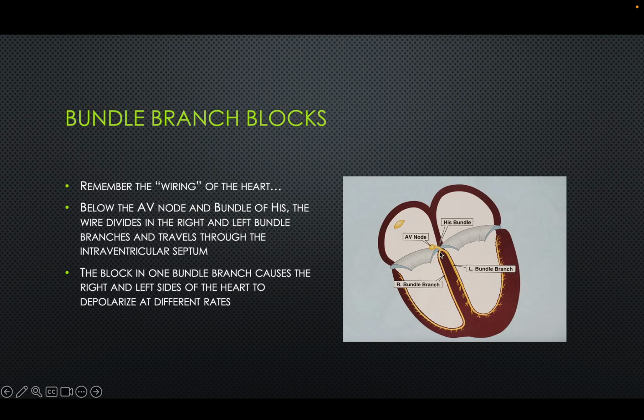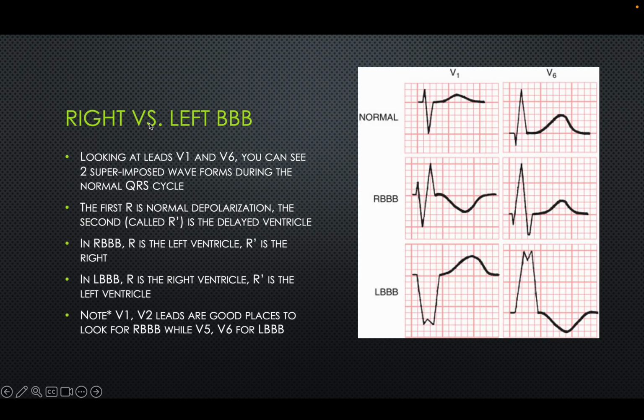And so the biggest way to distinguish a bundle branch block is that there are essentially two QRS patterns. Right? And so sometimes we call these rabbit ears, and I'll show you exactly what they mean. So in a normal heart, we're looking at V1 and V6. If you're looking for bundle branches, these are your focal points. You look at the chest leads, V1, V6, and in a normal scenario, you see V1 is mostly negative, V6 mostly positive, and you can see how that would look normal.